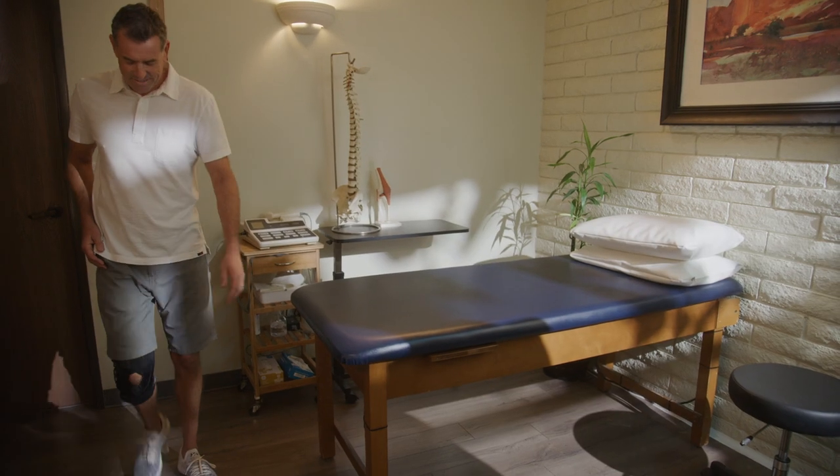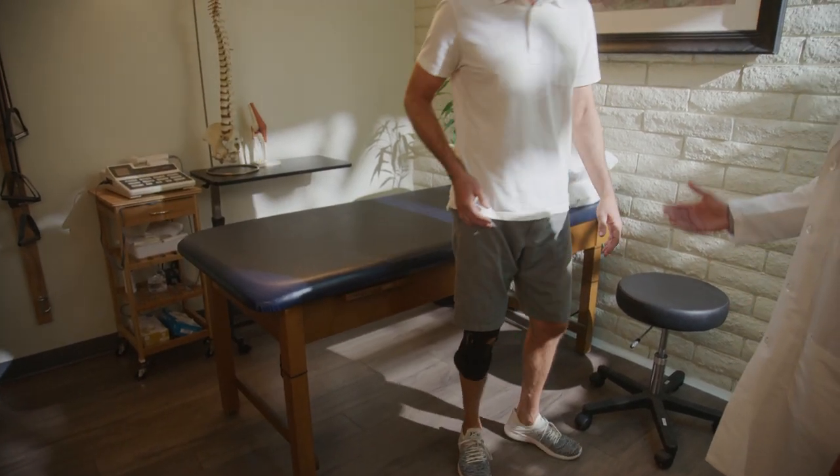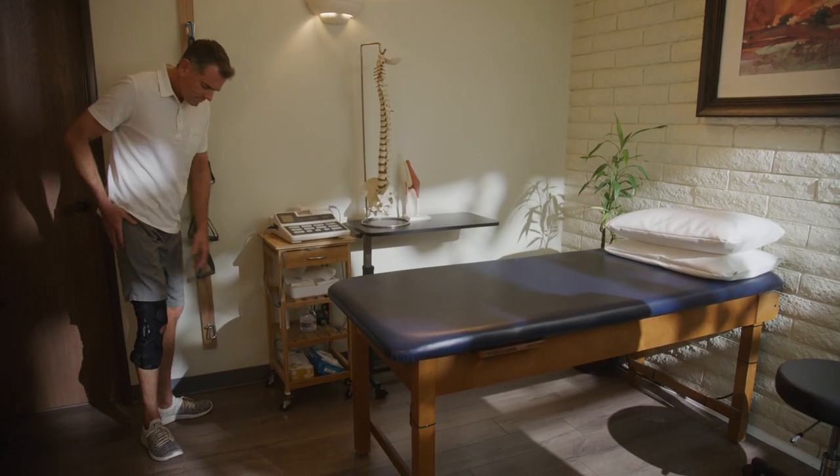For optimum results, the brace should stay in position and not move up or down while the patient is walking around. Clinicians should always determine proper adjustments, wear time, and flexion and extension limits.